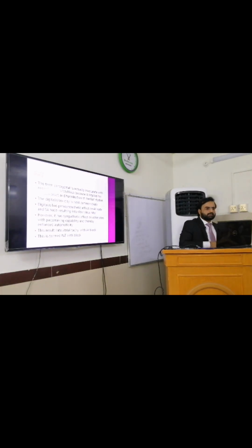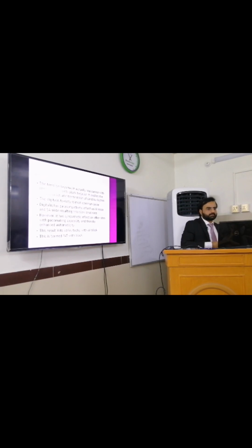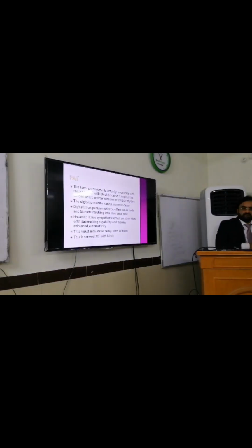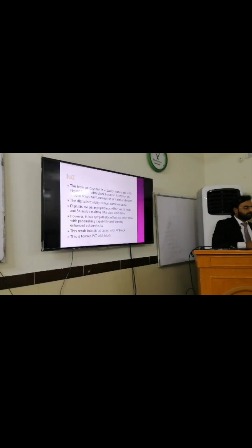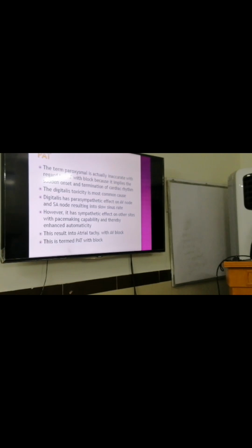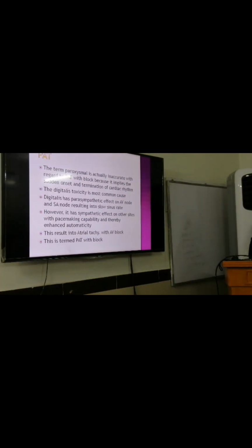So what is the mechanism of the arrhythmia here? Automaticity. I mean every cardiac myocyte has a potential to depolarize in some underlying clinical conditions. Okay, so the second variety of the atrial tachyarrhythmia is PAT, paroxysmal atrial tachycardia.